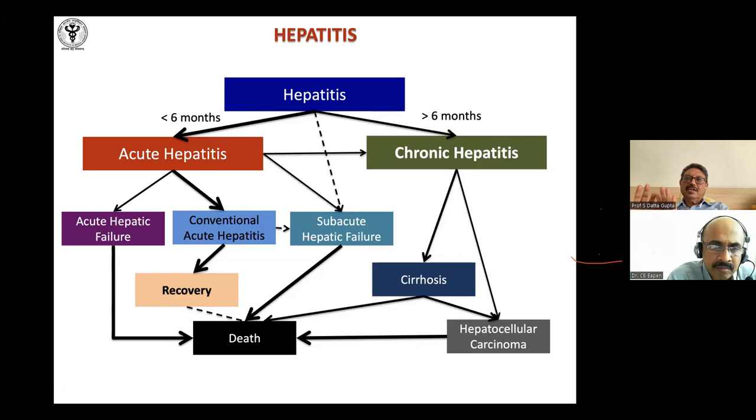Then supposing you are suspecting, say, Wilson's disease or anything, then you have to do copper stains. You want to do it for hepatitis B surface antigen. Nowadays, if it's HBV, generally we do immunohistochemistry for S and core antigen. Others we don't do. If it is HCV, we generally don't do any of them. So it is H&E, diastase PAS, reticulin, and a collagen stain in all biopsies. Then the other ones, for iron, you are absolutely right, depend on the clinical picture. Or after doing this, all of a sudden we find a lot of hemosiderin pigment, then we would like to do an iron stain for whatever cause there is, and so on.